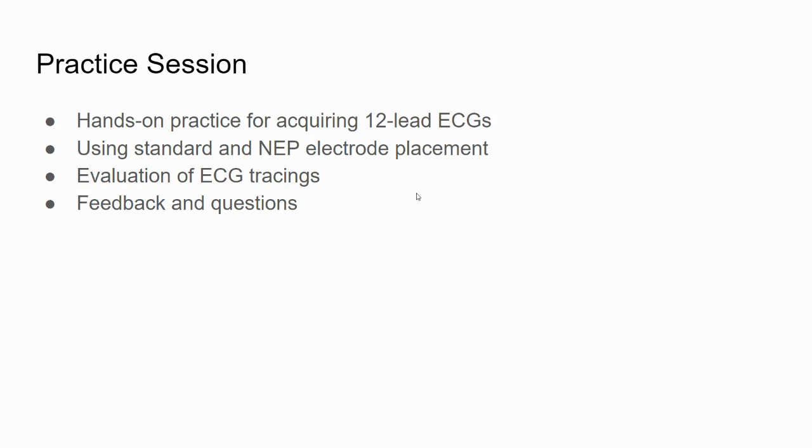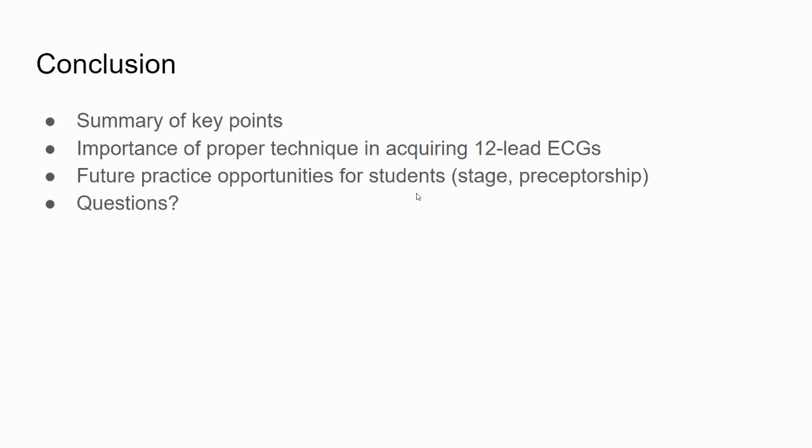We'll actually practice doing 12-lead ECGs. We'll practice reading the ECG as well, or at least following the steps. We'll do both the standard electrode placement and the NEP electrode placement. And please let me know if you have any questions. Don't hesitate to send me an MIO.